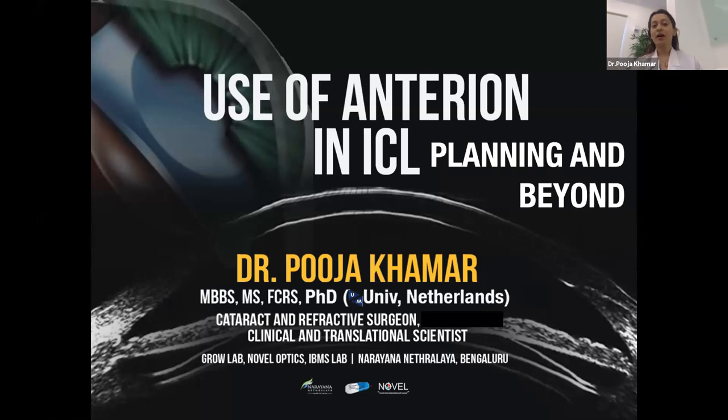We do a lot of ICLs in our practice, and as Dr. Rohit Shetty sir mentioned, it needs your topography for curvatures, it needs your anterior chamber depth, so probably you go back to the OCTs and do it. It needs white to white, and it needs sulcus to sulcus whenever there's a doubt, to differentiate the discrepancy. So whenever you do this, you have to go to multiple machines.